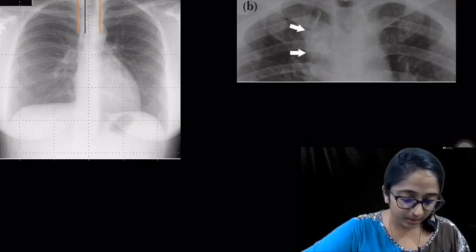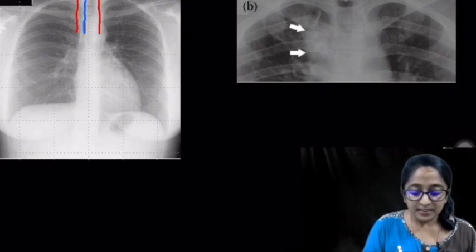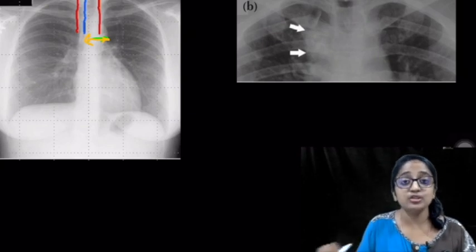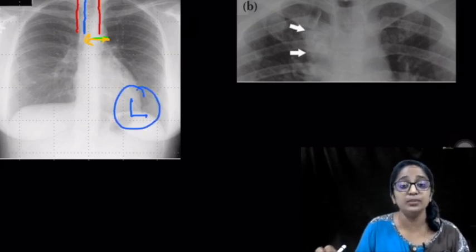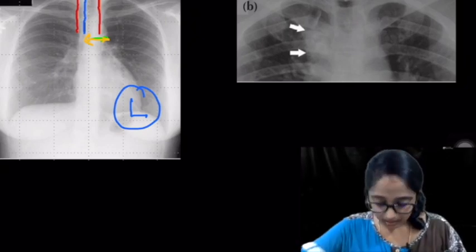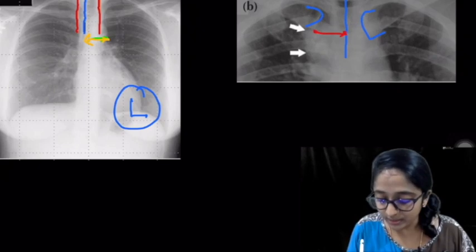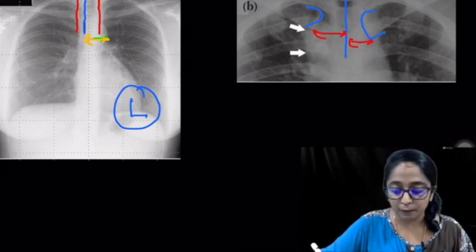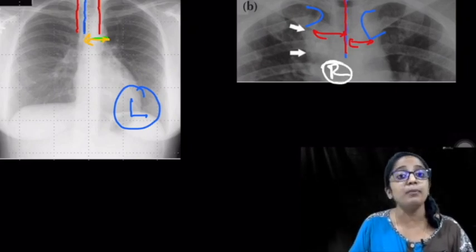In the first example, marking the spinous process line and the medial ends of both clavicles, the medial end of the left clavicle is at a greater distance than the right — so this radiograph is rotated to the left. In another example, the medial end of the right clavicle is at a greater distance from the spinous process than the left — so that radiograph is rotated to the right.